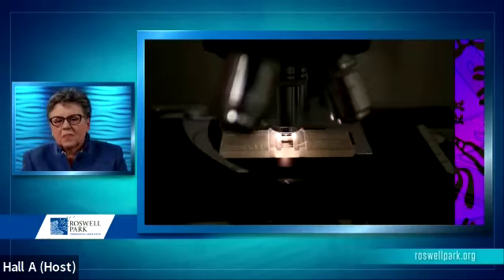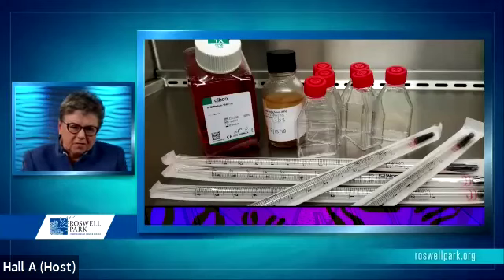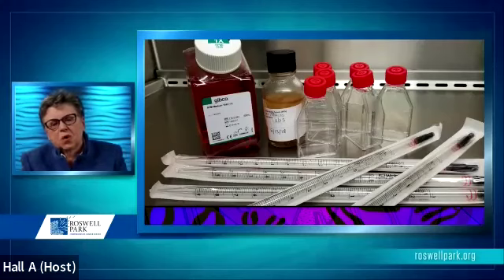So let's just kind of go back. Every cell culture that we perform in our laboratories, we like to use cells at a concentration of about half a million cells per mL. Tissue culture requires a lot of reagents, some of them very costly, such as serum. Our culture medium that is used worldwide was actually developed here at Roswell Park.